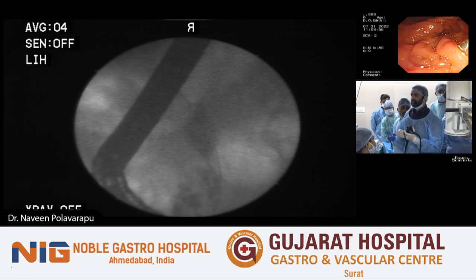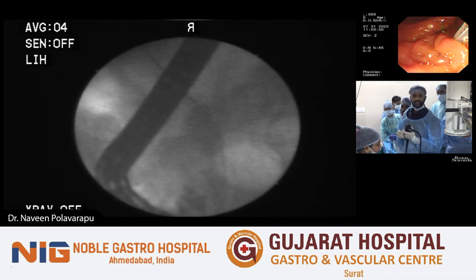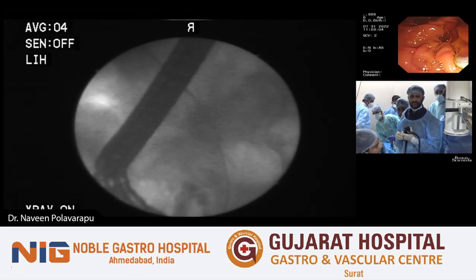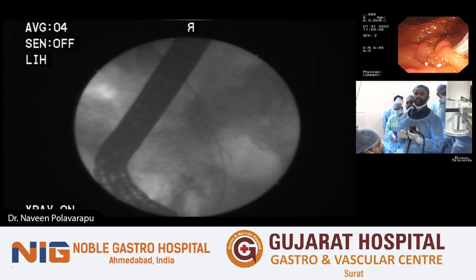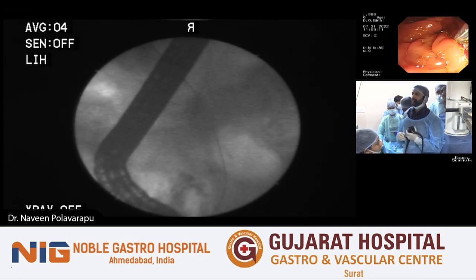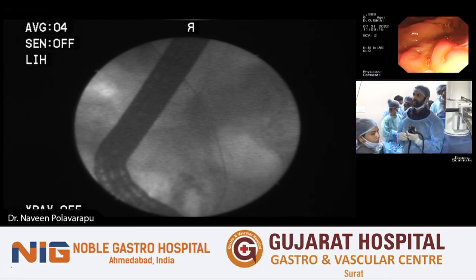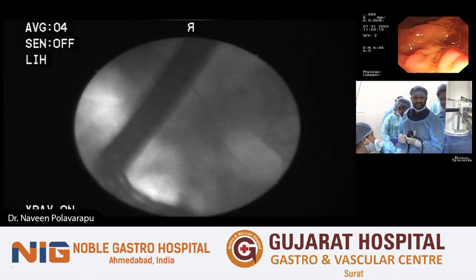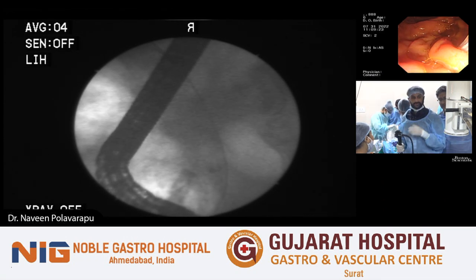But in this case, it was not a complete sphincterotomy. Balloon sphincteroplasty would have been an additional good thing. You need a big opening behind the scope. If you don't, and try to push around with the scope, you can damage the scope, and that's a very expensive affair. So it's always better to have either a sphincterotomy or a balloon dilation, a big opening. That's absolutely mandatory.